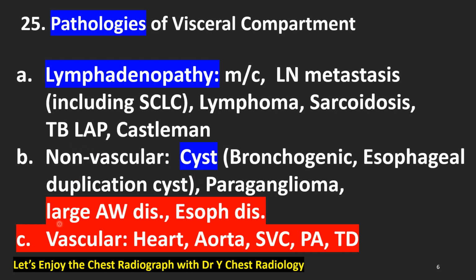The diseases of the large airways or esophagus, or about the heart, aorta, superior vena cava, pulmonary artery, and thoracic duct are too big to be dealt with in this mediastinal session. I'll introduce them to you in a later session.